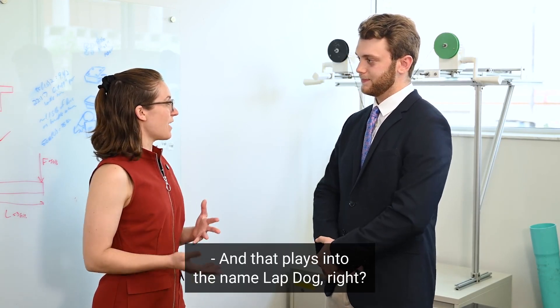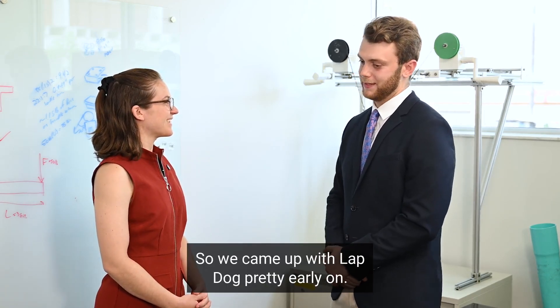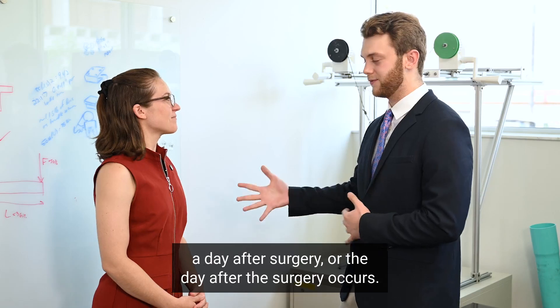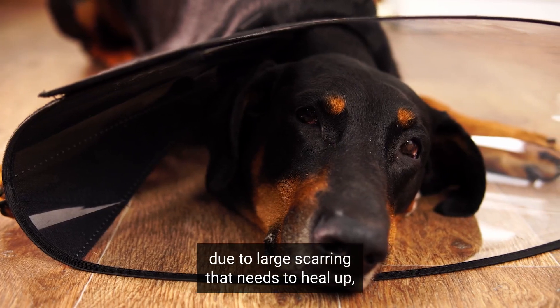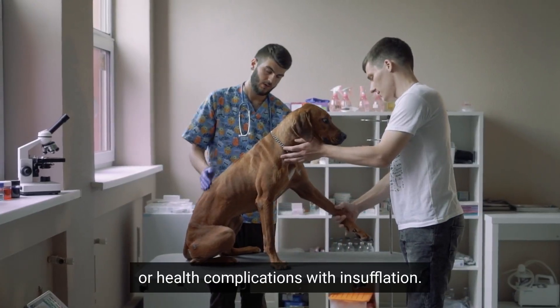And that plays into the name LAPDOG, right? Yes. We came up with LAPDOG pretty early on, and it stems from our mission statement: we want to have the dog in the owner's lap the day after surgery. Whereas right now that's not usually possible due to large scarring that needs to heal, due to either invasive surgeries or health complications with insufflation.